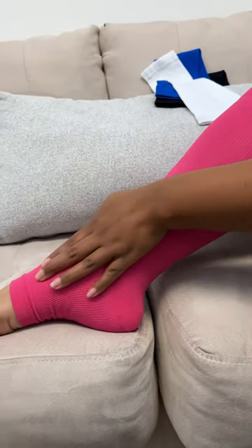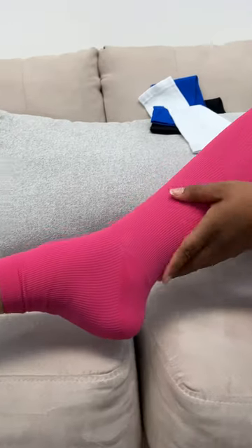Most compression socks and sleeves on the market don't fit my legs, and I love that these are designed especially for my size. Graduated compression means that they are tightest at the ankle and support gradually decreases up the leg, which aids in blood circulation.